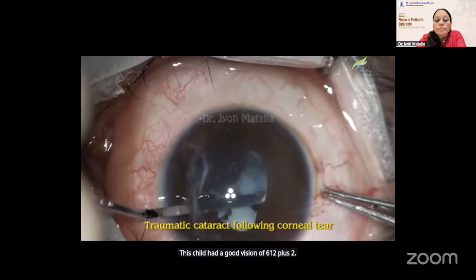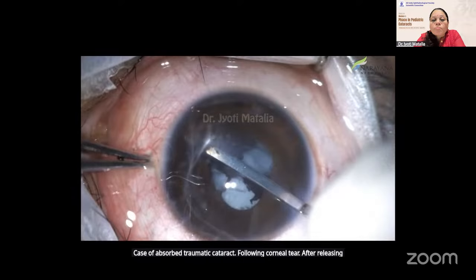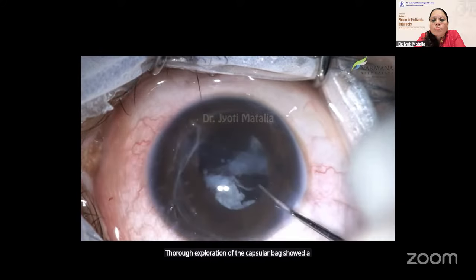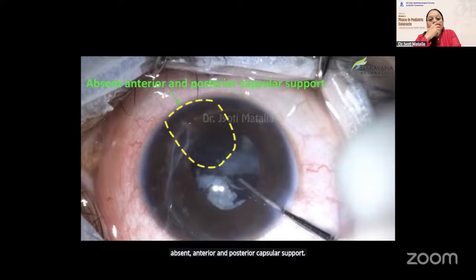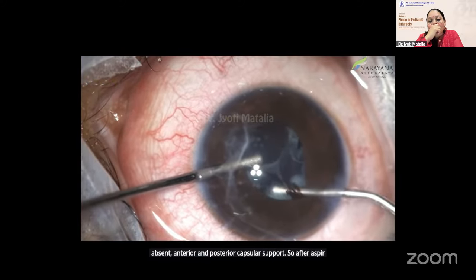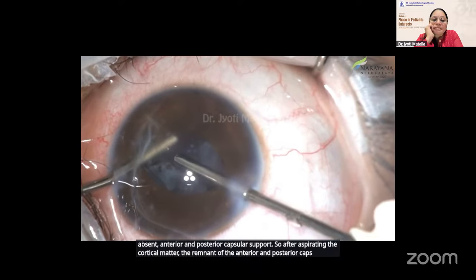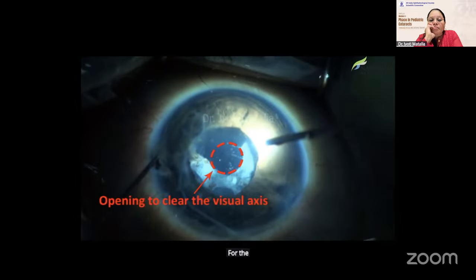Case of absorbed traumatic cataract following corneal tear. After releasing the synechiae, a thorough exploration of the capsular bag showed a wedge extending over 2 clock hours of absent anterior and posterior capsular support. So after aspirating the cortical matter, the remnant of the anterior and posterior capsules was retained as a support for the IOL, except for the central area to clear the visual axis.